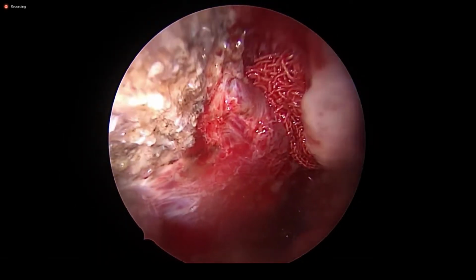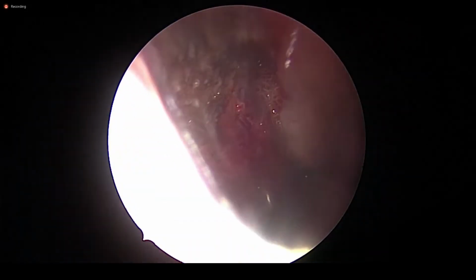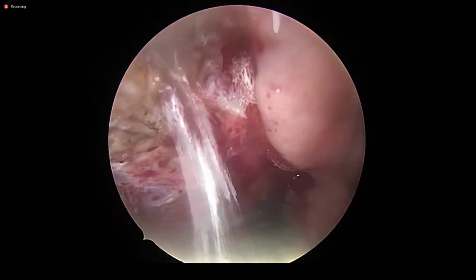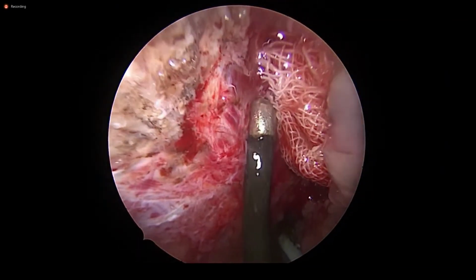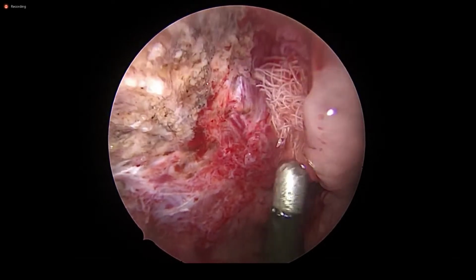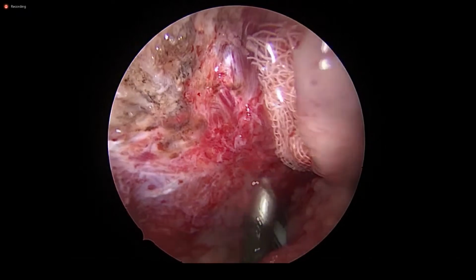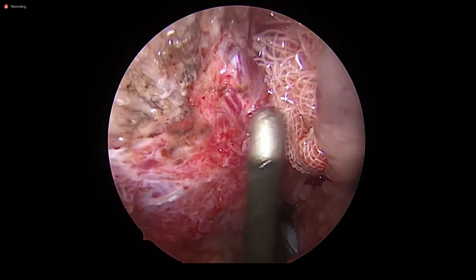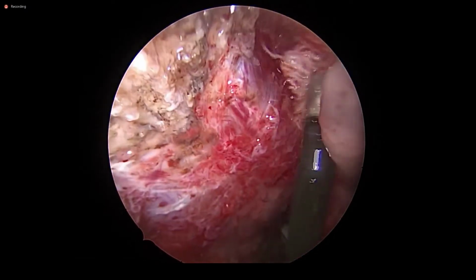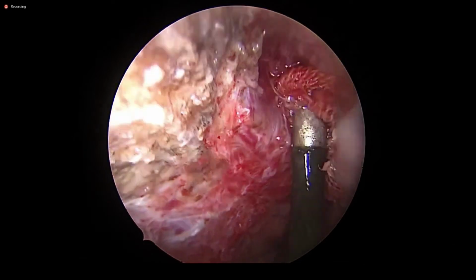Can you see? Yes, sir. Gently. It is very, very safe, provided you don't poke into it blindly. You just press on the muscle. See this muscle? The rest of the superficial adenoid automatically falls into the blade. Your goal is very clear. We are not supposed to forcibly introduce anything blindly into this region. See, this all opened up.